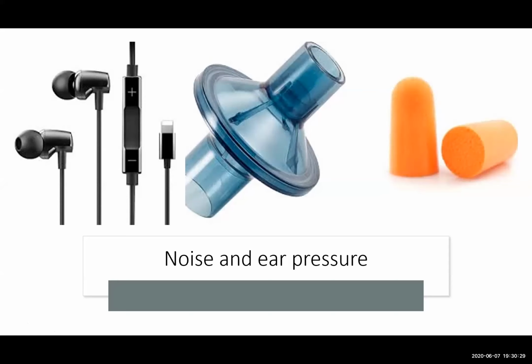With the setup that we are talking about right now, which is the use of a ventilator, it's not as loud as using the Venturi system that is not connected to a ventilator. One of the possible troubleshooting options that might help is attaching another filter to the inspiratory limb that works as a sound muffler.